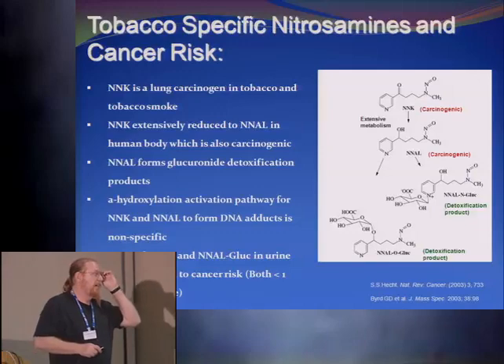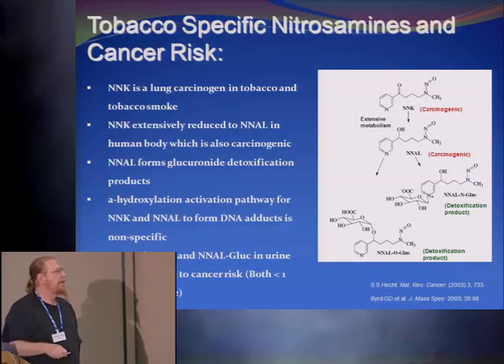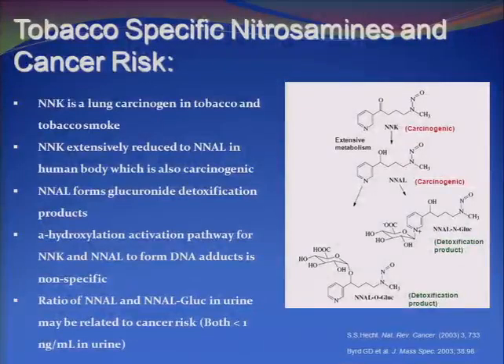Okay, so this is the second project, the second PhD project. What we wanted to look at was tobacco-specific nitrosamines as an assessment of cancer risk. And this is going to be done with an LCMS detector, but we were trying to do it with no sample preparation. So basically just take a urine sample, inject it through one of these capillary columns, and then directly into the mass spectrometer and get your assessment of cancer risk.